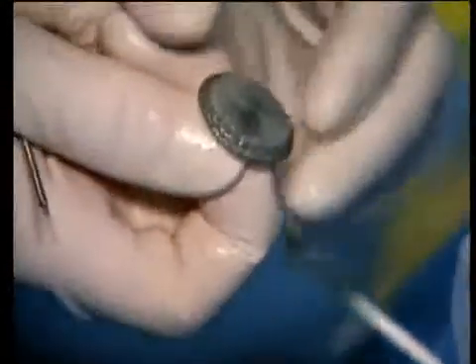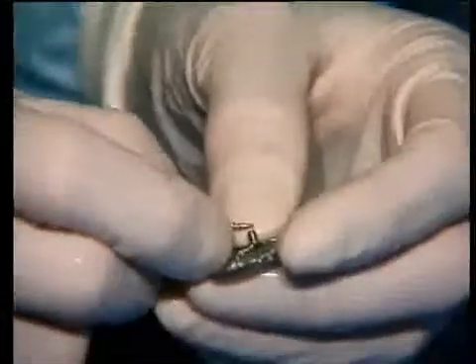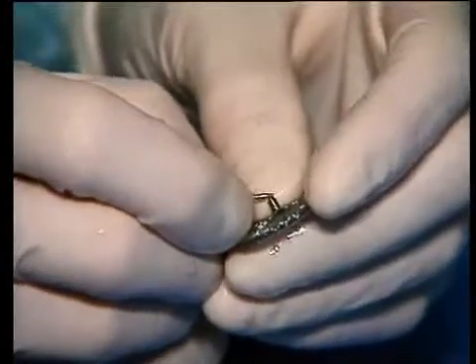Yes, so you see there's a single layer here. The attachment system is the same — it's a screw. What about the covering material — is it Dacron? It's Dacron, like the Amplatzer.